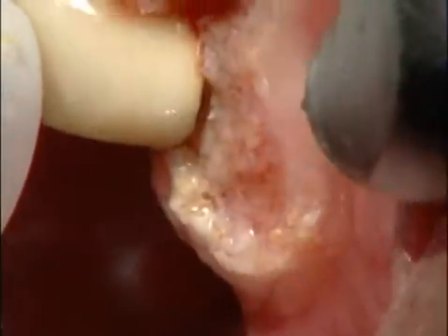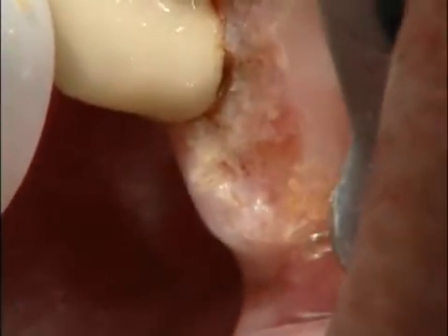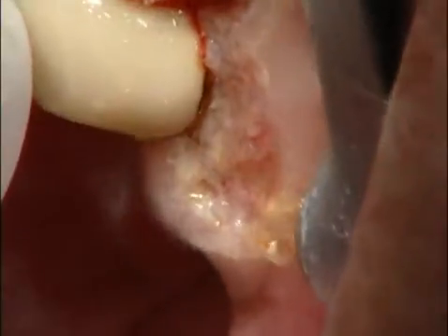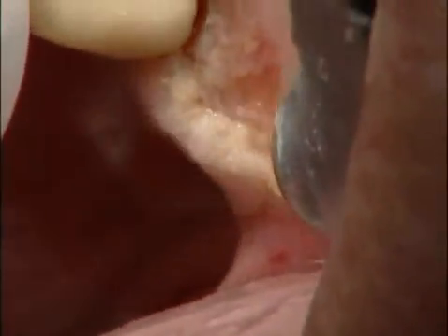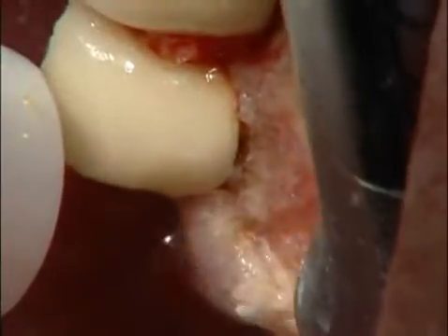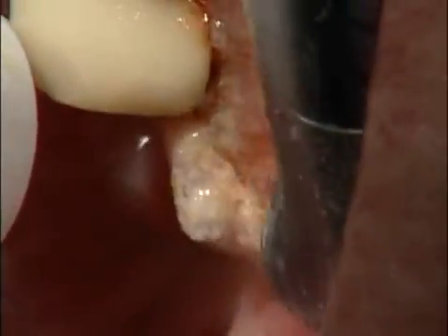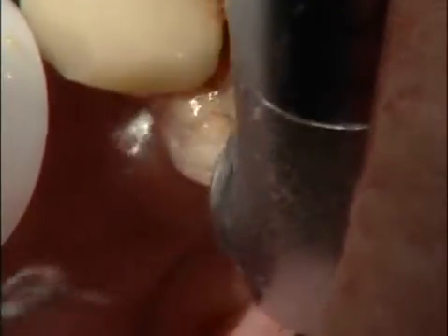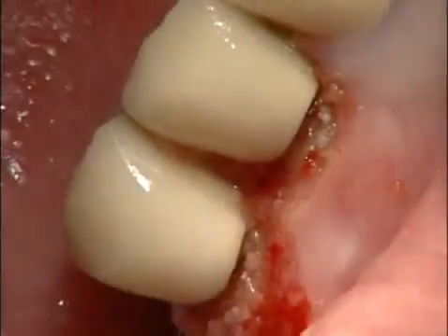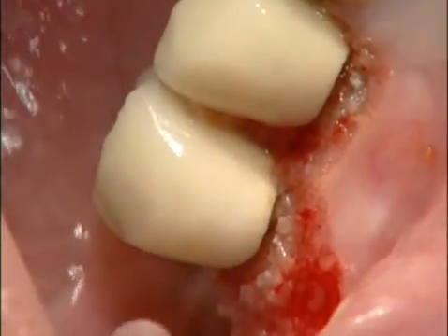It's also important for this patient not to stir up bacteria. So as I'm using the laser, I'm also decontaminating with little chance of infection occurring after the surgery. You can see the nice smooth gingival margin. Very little bleeding, and remembering still on her Coumadin.